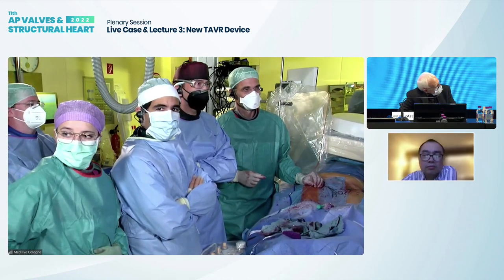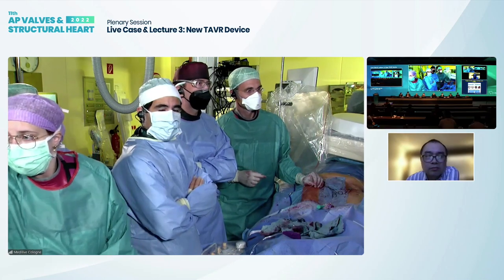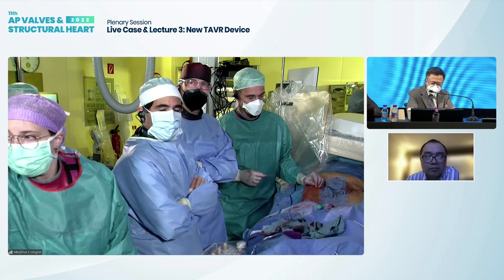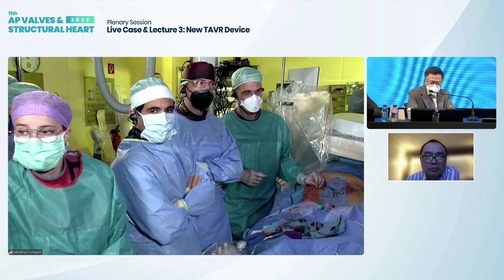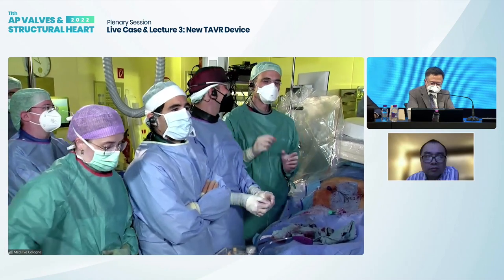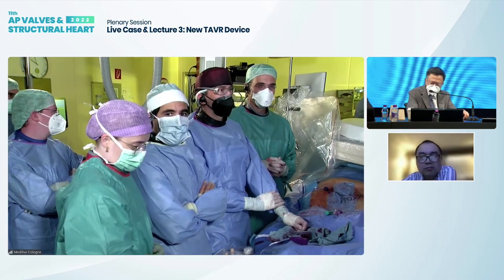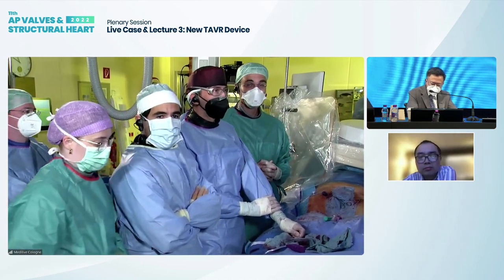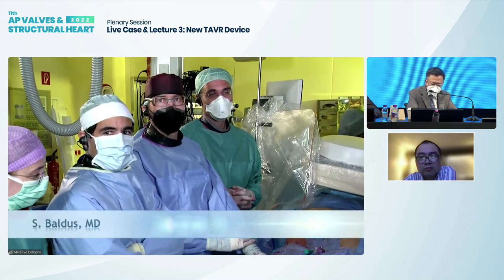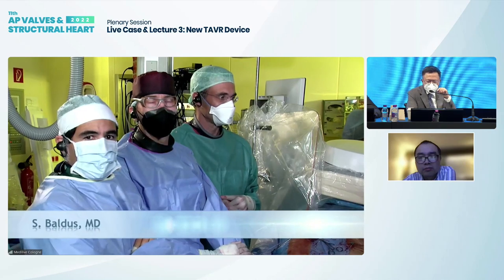Any questions from the panel? Yeah, can I ask a question? What is the pacemaker rate again? Sorry, for AS, is there any? Because the valve part of it is actually not touching the septum, right? Because it's kind of hanging in there. This is an extremely important point. In AS, the pacemaker rate is below 5%. However, in patients with pure AR, it's higher. It's above 10%. In our case, we have no pacemaker need.